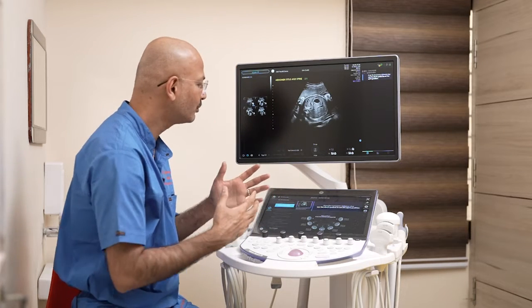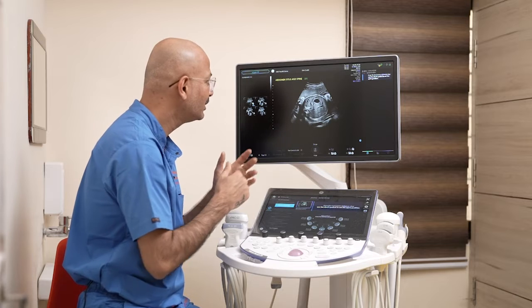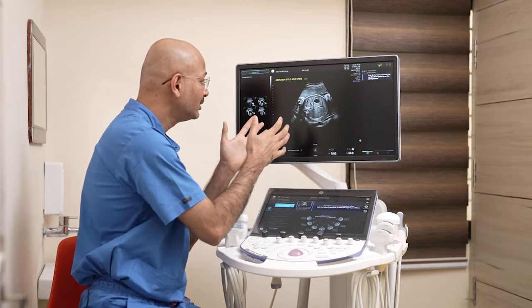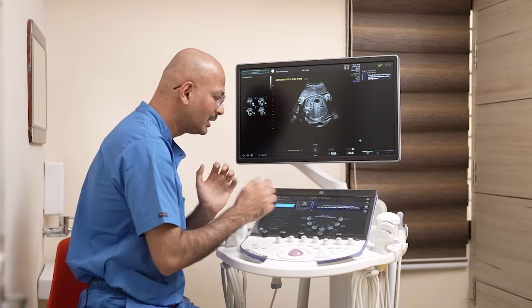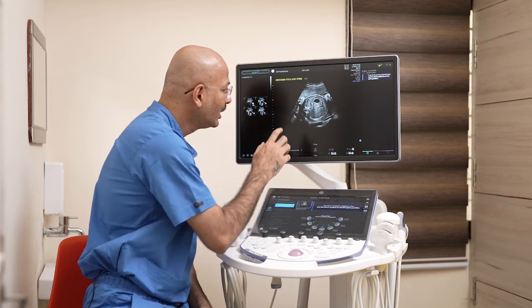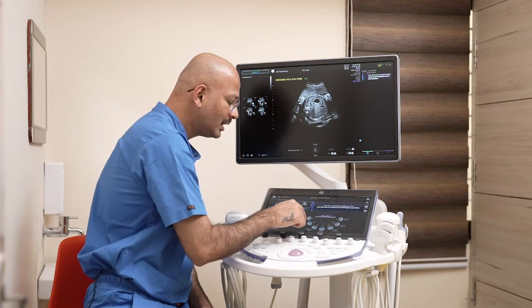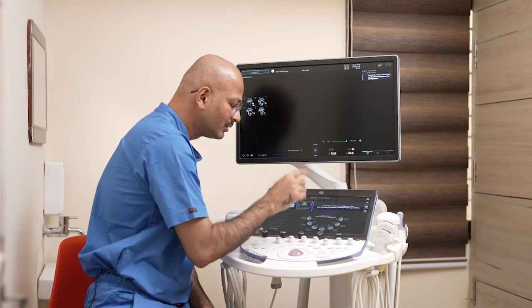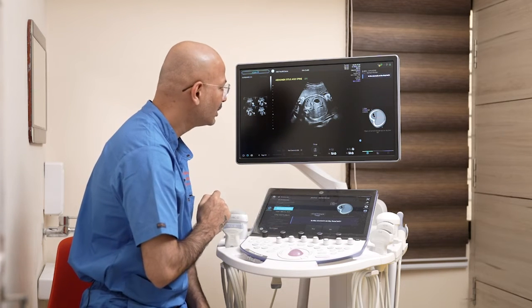Now the software is asking for abdominal situs along with the spine. Here are the numbers in clockwise position. In our case, it is 8 o'clock, so I'm clicking 8 o'clock.